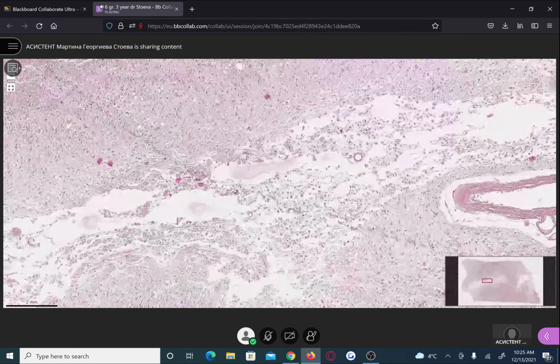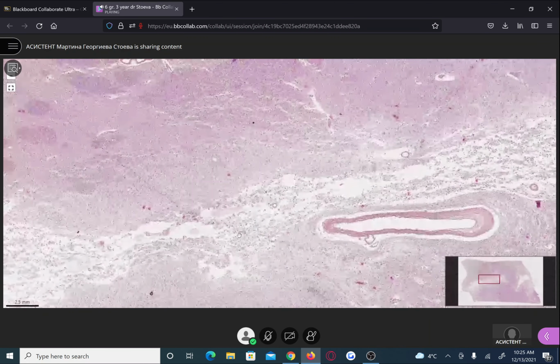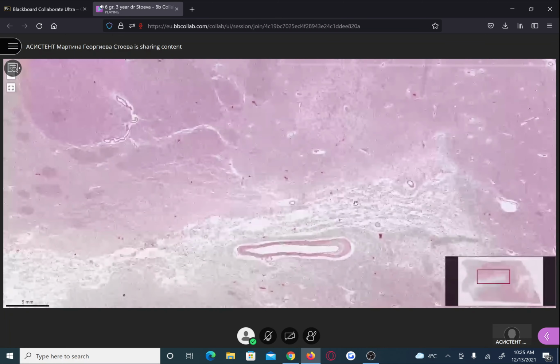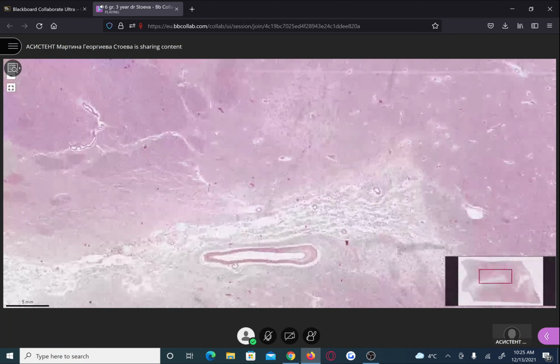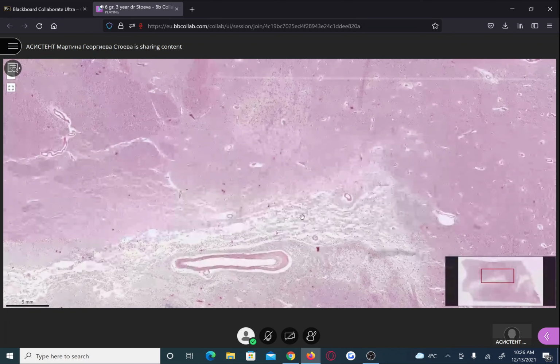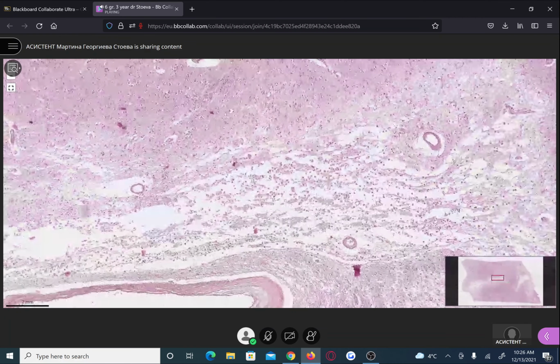So this is the end stage of a brain infarction. It takes a few weeks to develop. Here in this slide, we do not have a fresh infarction like it was in the myocardial infarction and in the pulmonary infarction. Here, this is an old infarction. It takes at least 4 weeks. Of course, it depends on the size of the infarcted area, but at least 4 or 5 weeks are needed for this pseudocyst to develop, which means that the whole necrotic material is completely removed by the macrophages.